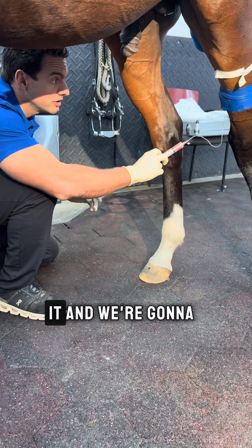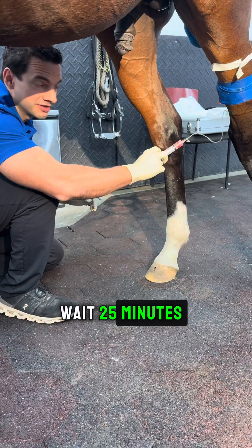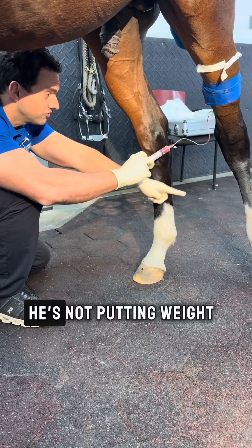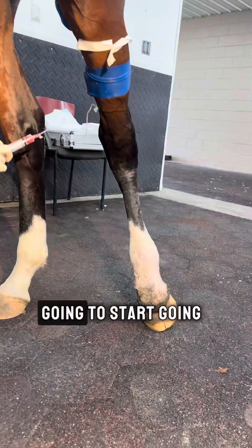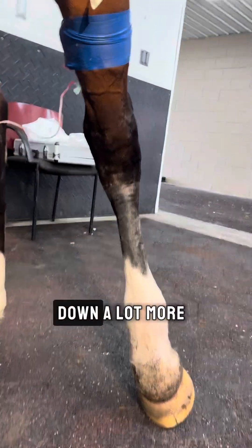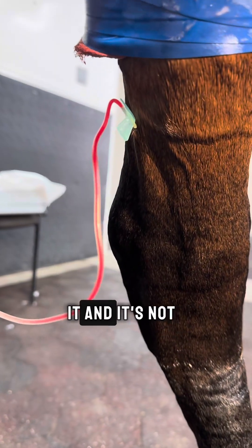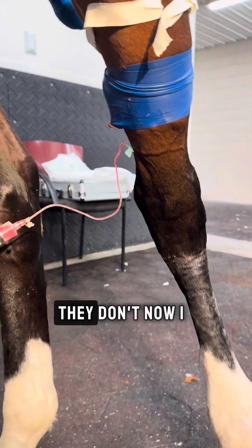We're going to put it here, then we're going to close it and we're going to wait 25 minutes. It's good that he's not putting weight on it — that means he's going to start going down a lot more. A lot of times they put weight on it and it's not a problem, it's just easier when they don't.